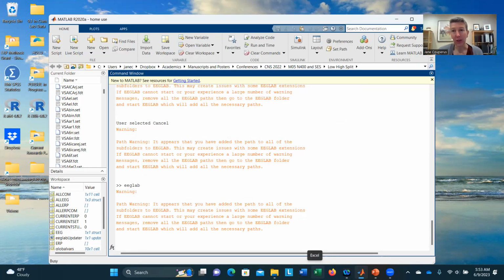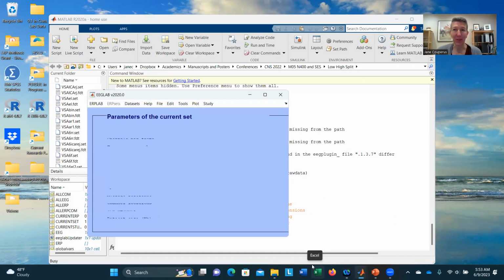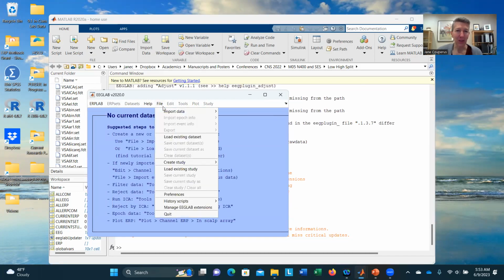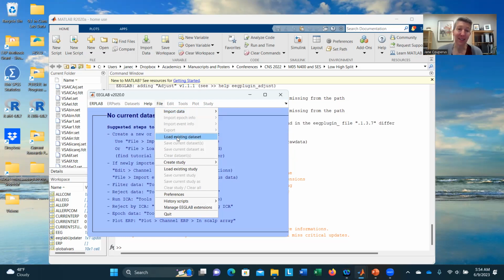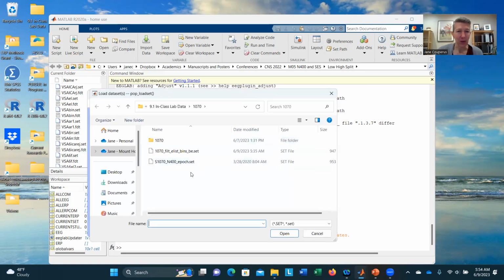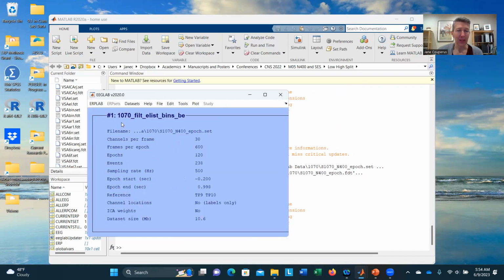Now, in the prior videos, we'd been starting with a raw data file. Today, we're going to start farther down in the stream of processing, just so that we don't have to walk through all of those different steps. So instead of doing our raw data file like we've been doing, I'm going to use load existing data set because I already have a data set. So in this case, I'm going to be using this one. It's subject 1070. It's one that I've labeled as epoched, but that's as far as it's gone. The nice thing is when I open this data set, you'll see that it's data set number 1. It tells me what the different things I did to it already. So I filtered it, I had an EventList, and I assigned those bins, and I extracted the bin-based epochs. So that's where this stage is at.